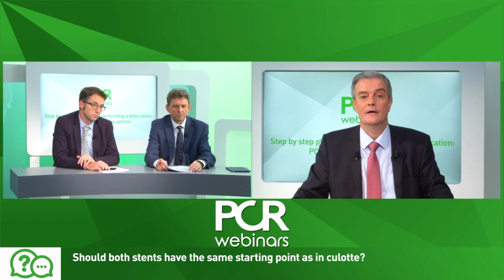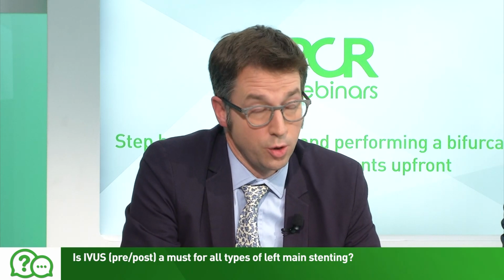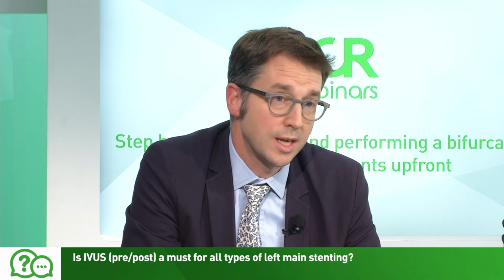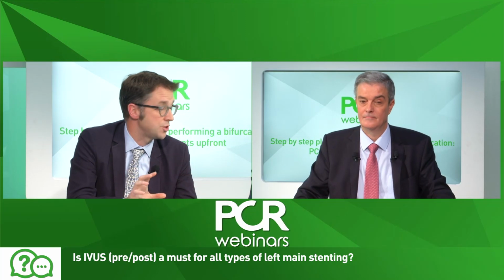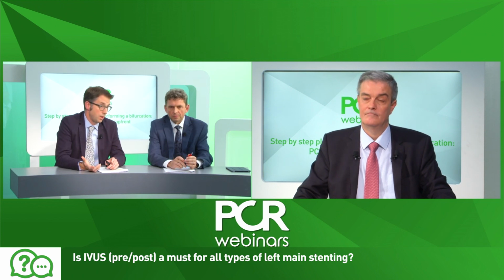And another question: these are final images. You are the first author of the ESC consensus on imaging use, the second part of the consensus. So a question for you: is IVUS pre and post a must for all types of left main stenting? So my personal view, a must, I think no. We have to be realistic, and there are going to be cost implications, and there are going to be times when the patient is too unstable. Does IVUS assist in left main intervention? Absolutely yes. And we see here that, taking it from the beginning to the very end of the procedure, it's influenced every single decision, and I think it's probably made for a safer and more effective procedure.